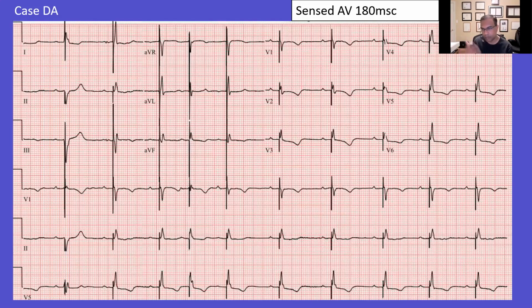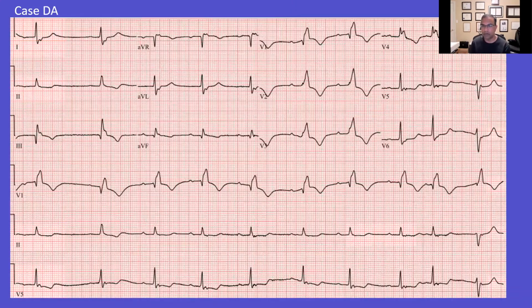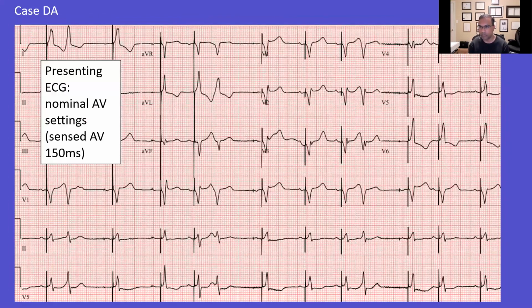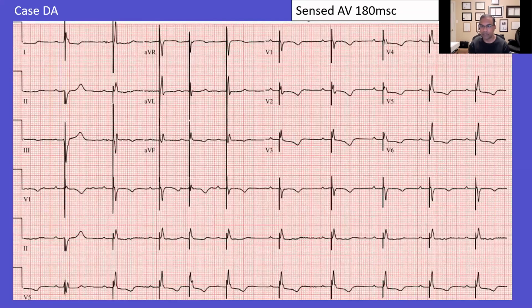Right. Well, the right bundle, there's nothing conducting down it, but that conduction block may be quite distal. So if you can lengthen that AV delay, give a little bit of a chance for that proximal right bundle to depolarize, and then fusion pace at the correct time with the left bundle, it's gorgeous. It's truly physiologic pacing.